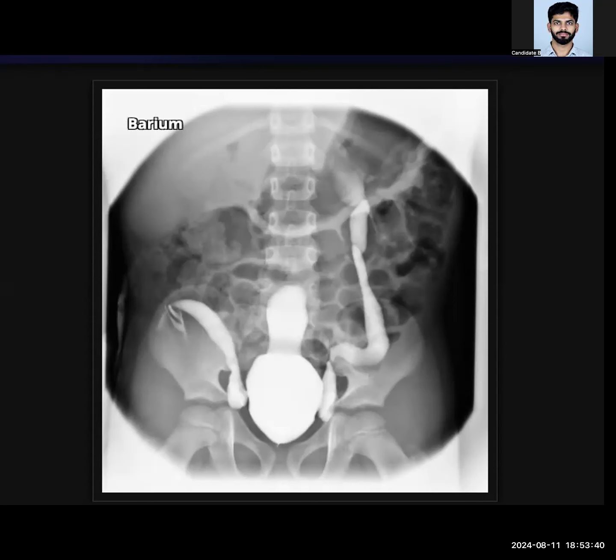If there is abdominal distension, vomiting, that would be supportive. The bowels are completely fine.